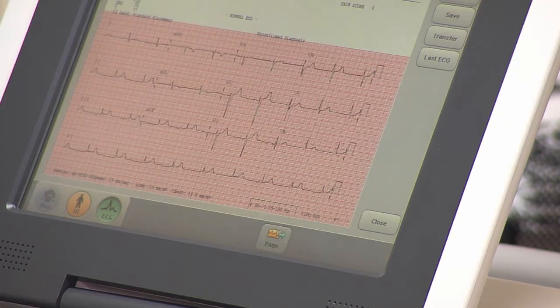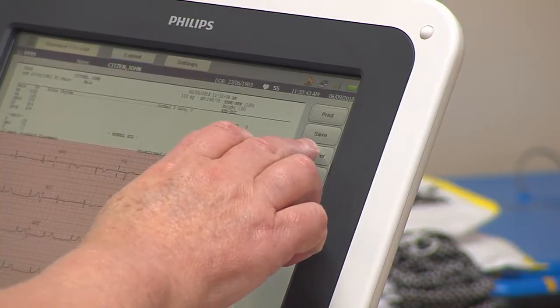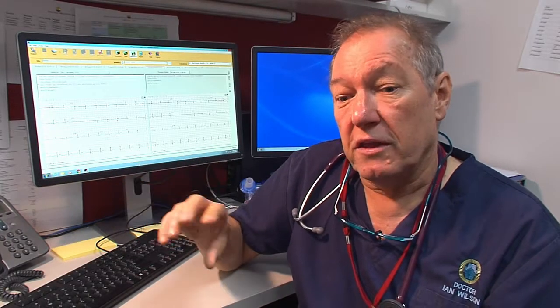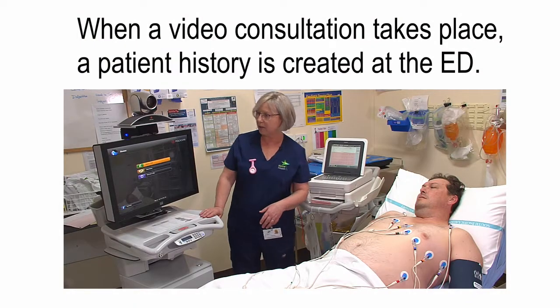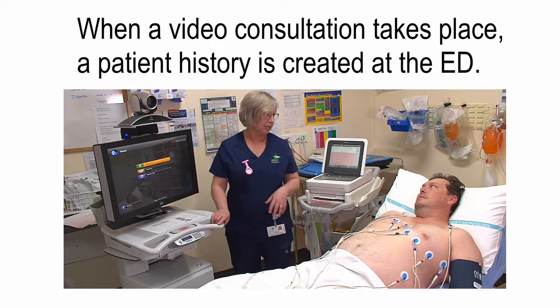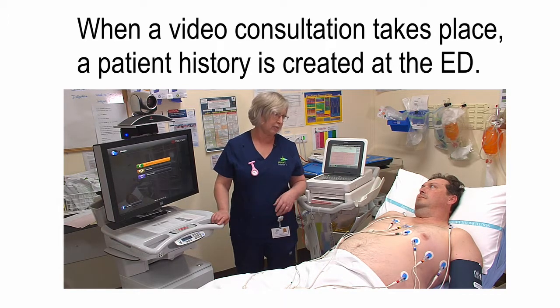When you look at the digital ECG system, there are a couple of things that you're looking for. You're thinking, can we manage this patient up there locally? If I have a look at the ECG, talk to the doctor, and then keep the patient there, there's nothing that is a red flag that they need to be brought down. The other possibility is that you've got a patient and you think, gee, there's something worrying about this, there's something worrying about the ECG, there's something worrying about the patient. You may decide you're going to do a telehealth consult and say, no, this patient looks too sick. A whole range of things that would say, I need to transfer this patient down to Wangaratta.